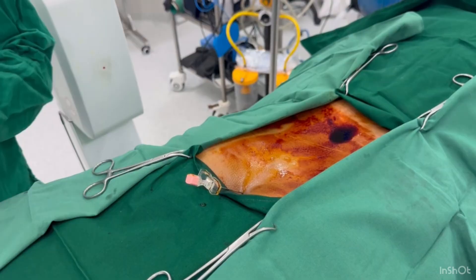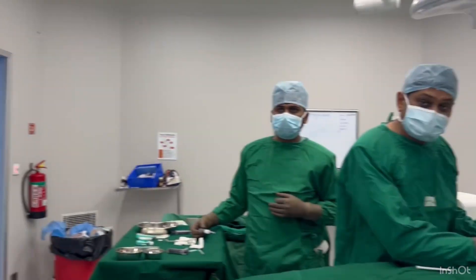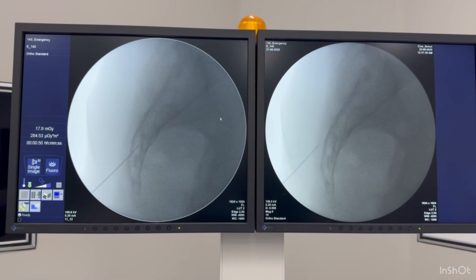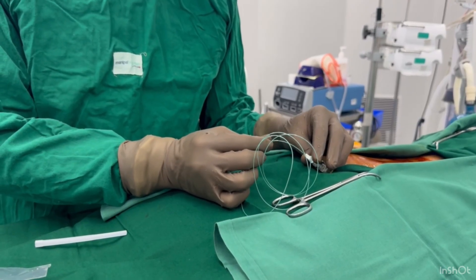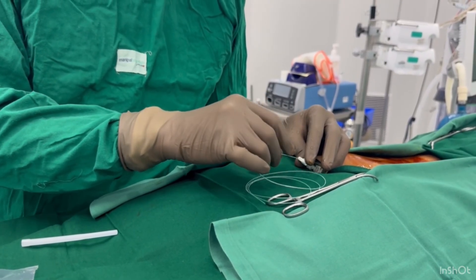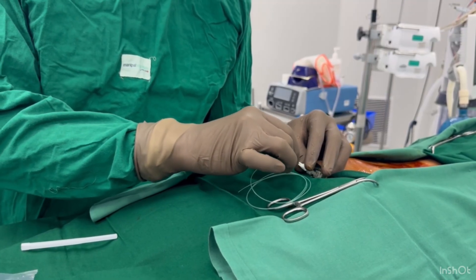We are now putting the epidural needle through the sacral cornua, as you can see on the C-arm. We are now going to deliver the solution at the affected site.